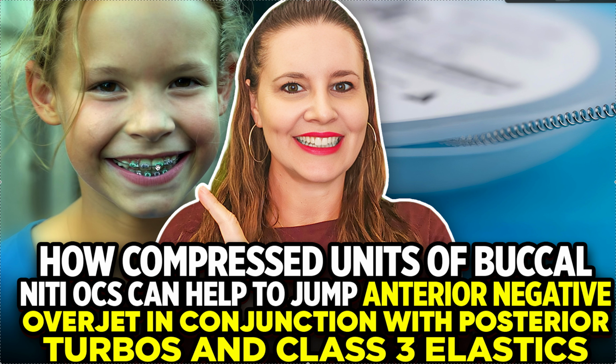If you still are having negative overjet in this stage, but the patient is class 1 and there's no major skeletal problem, then what you can do is put 2 units of compressed open coil spring. This is how open coil spring usually comes in a spool. Sometimes it's in long sticks. You need to make sure your open coil spring, this is super important, is NiTi open coil spring, not stainless steel open coil spring. The stainless steel is not going to work. The NiTi will work. So compressed open coil spring means that we measure it from the distal of the 2 to the mesial of the 6 band or bracket, and we add maybe a centimeter, 10 millimeters, something like that. Add a little bit extra so that when we slide it on, we actually have to compress it.